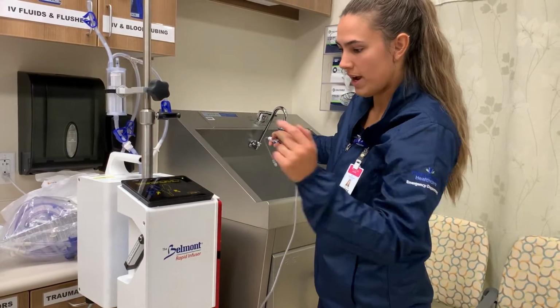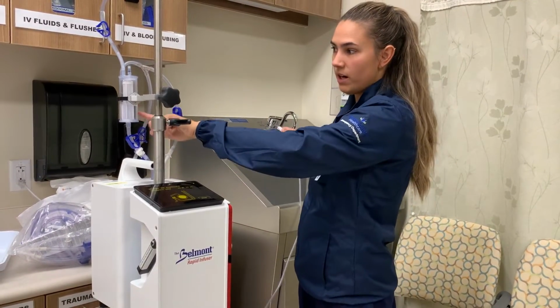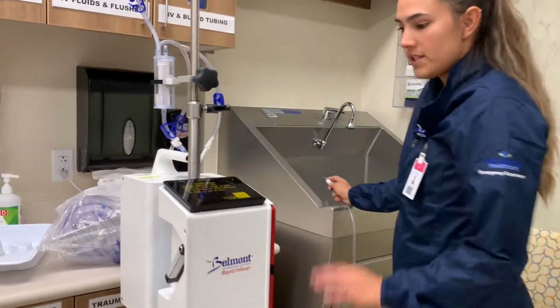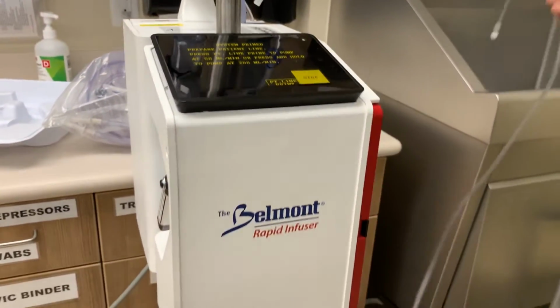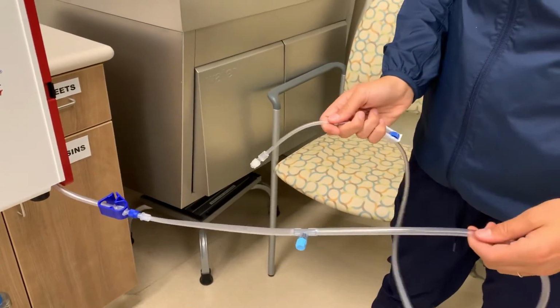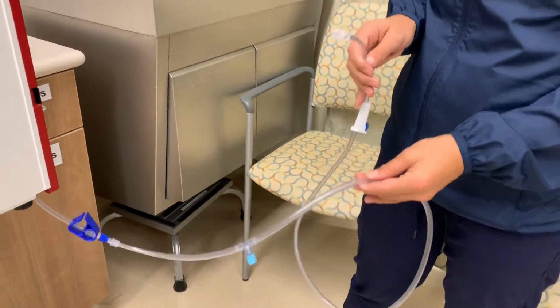I'm going to say prime. Now you can see the chamber filling up faster, and you can see the air bubbles, which is the device removing the air. It's important to note that, like I said, the tubing is only primed from up here and through the device. If you look down here, none of this is primed yet. So it's very important that you do not connect the tubing to the patient yet.